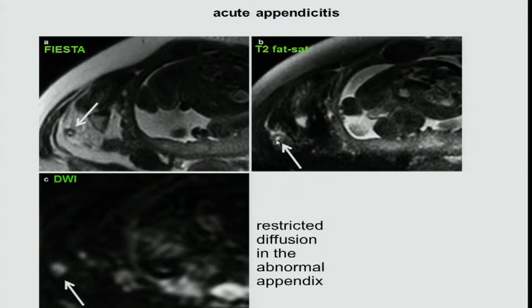These guys are trying to make decisions. They have to go back and talk to their attendings and say things that sound reasonable. So let's try to understand the physiology, understand how the physiology affects what we're seeing on our picture, and help them make surgical decisions by being confident about what we're seeing. No, I don't see any fluid around the appendix. I see fluid in the appendix. I cannot say that this is an early acute appendicitis unless I see inflammation around the appendix, because this could be fluid from the bowel. Everybody feel confident about that?